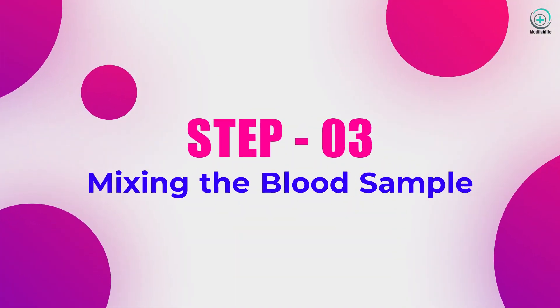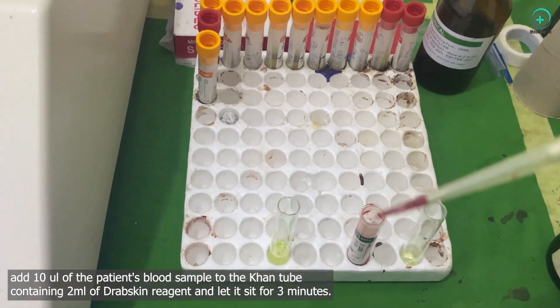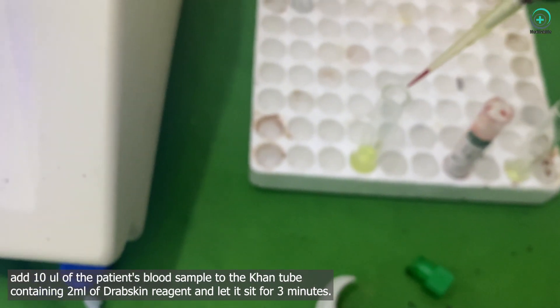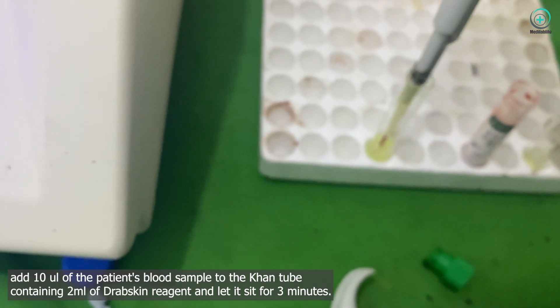Step 3: Mixing the blood sample. Use a micropipette to add 10 microliters of the patient's blood sample to the Khan tube containing 2 milliliters of Drabkin's reagent and let it sit for 3 minutes.